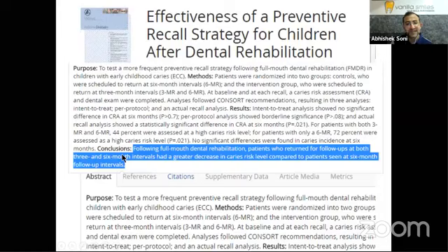So what exactly is this? Let's look at this tip number 7.5. If this cavity is going to remain open, there's always going to be a lot of food lodgement. The bacteria are going to keep multiplying.